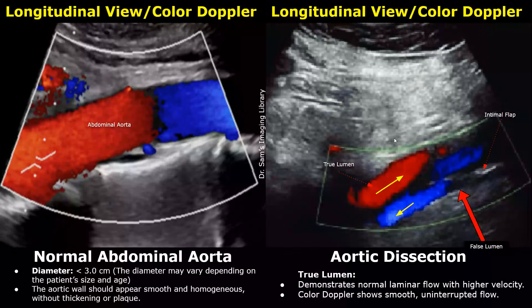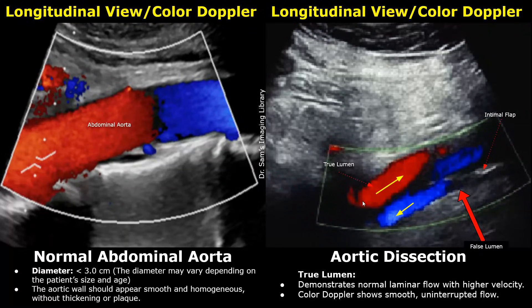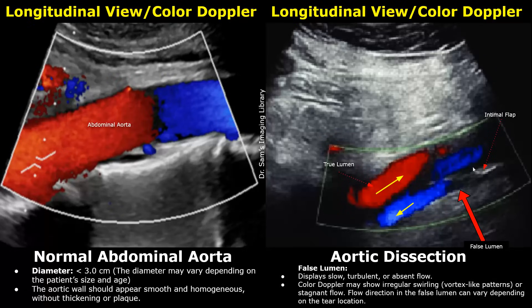Here is how an aortic dissection appears on color Doppler. The true lumen shows normal laminar smooth blood flow. The false lumen may show a swirling pattern, or the flow direction may even be opposite to the normal flow in the true lumen. In the image, you see blue colors, which means blood is moving opposite to the normal blood flow in the true lumen.